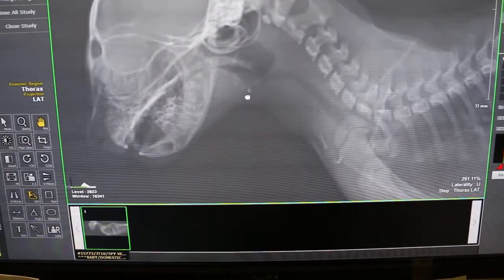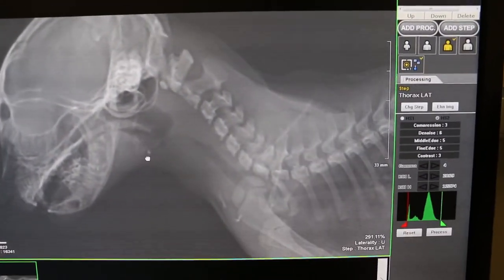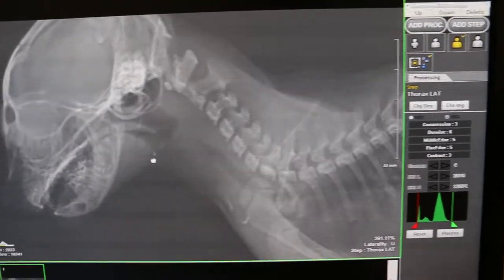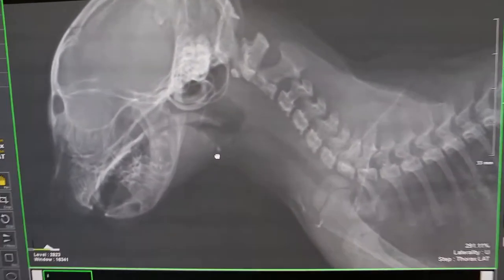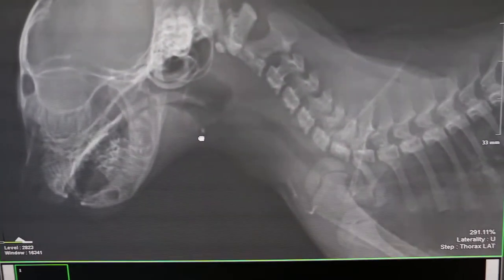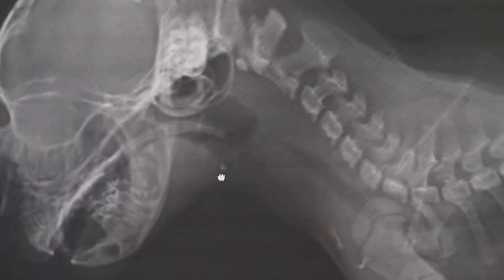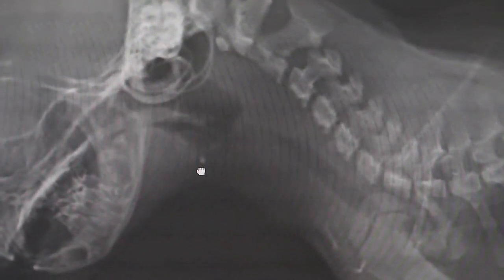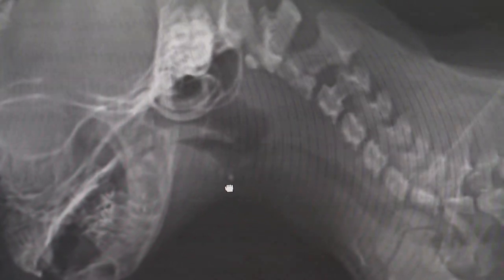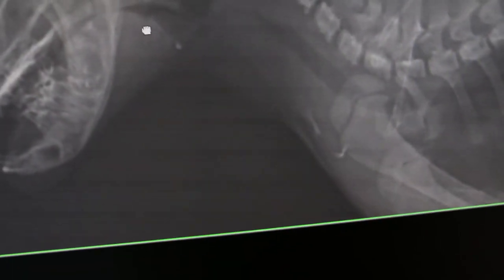Okay. Cannot see because it's not a bone, it's a plastic. Bone normally can see one. Doc, the dorsal ventral leg is difficult. Oh, cannot then don't do la. Just the throat, don't need the leg. That then might be a normal hyoid bone.